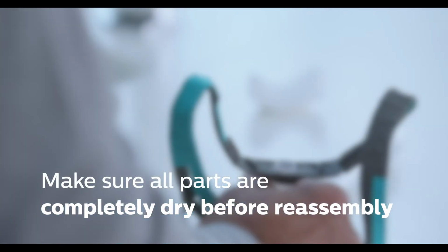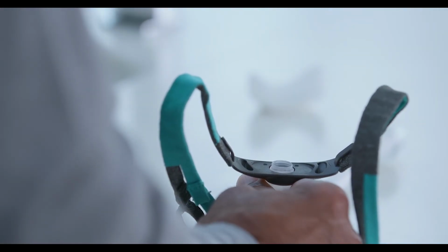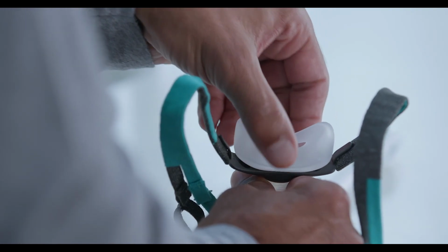Be sure all mask and headgear parts are completely dry before you reassemble them. This is a good time to check your mask for cracking or tears and replace any worn or damaged parts. For complete assembly instructions, refer to the assembly and sizing video.